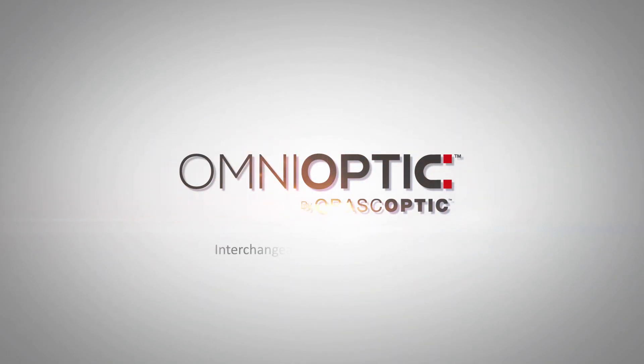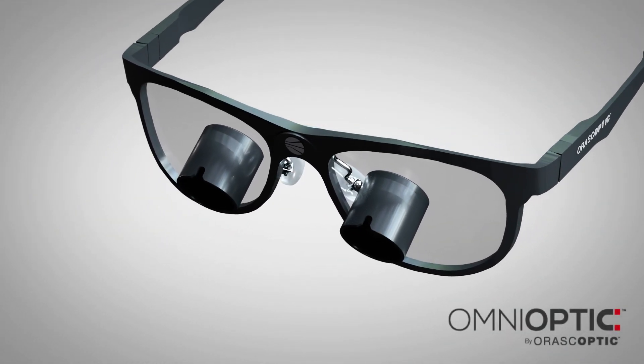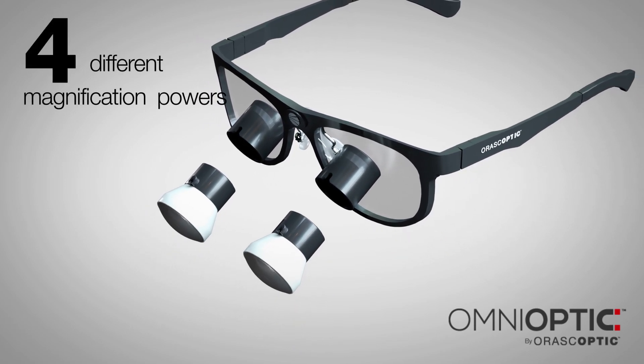Omnioptic — the interchangeable magnification loop. Omnioptic is the first and only loop to utilize interchangeable telescopes. These interchangeable telescopes allow the user to switch between up to four different magnification powers.